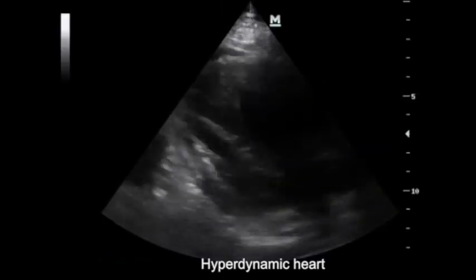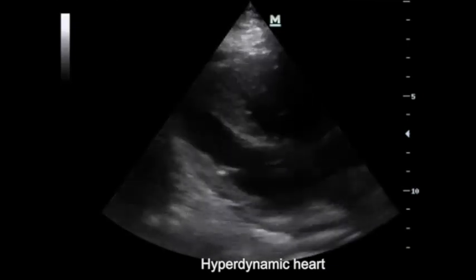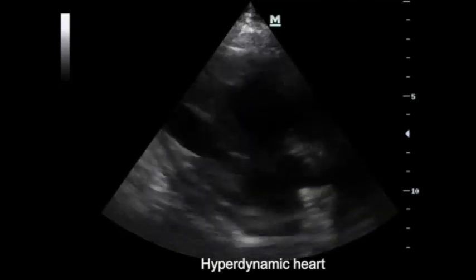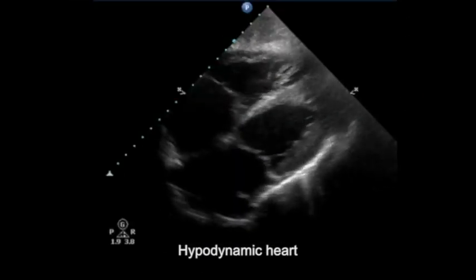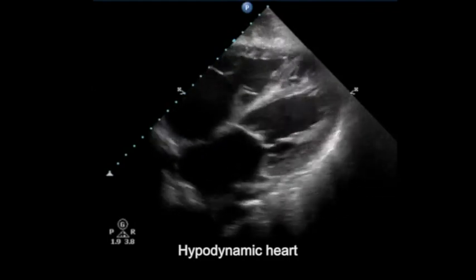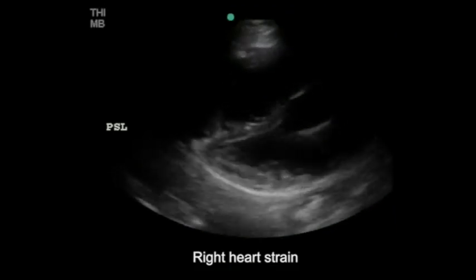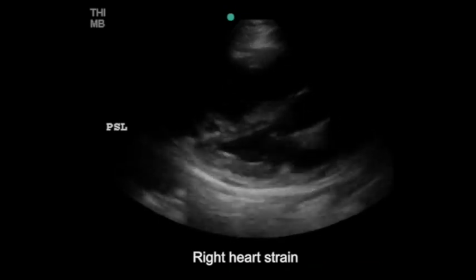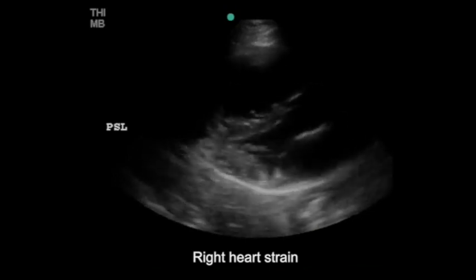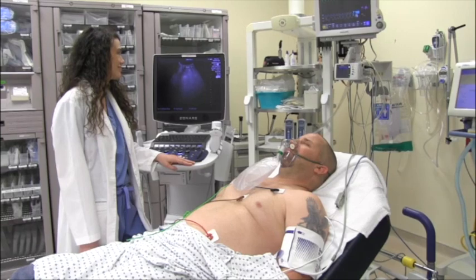If the patient does not have enough blood return to the heart, for instance in hemorrhagic shock, the heart will be hyperdynamic. The patient will have a rapid heart rate and a high ejection fraction. A patient with congestive heart failure will have a hypodynamic heart with a low ejection fraction. Finally, if the patient has a large pulmonary embolism, evidence of right heart strain can be present. Normally, the left ventricle is larger than the right. Here we can see the right ventricle is larger than the left.